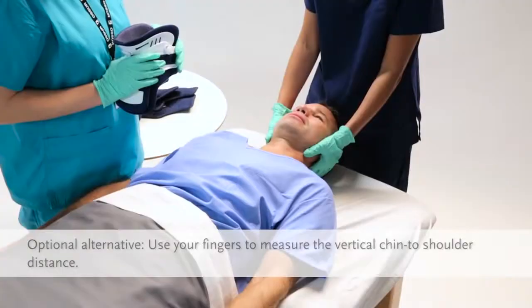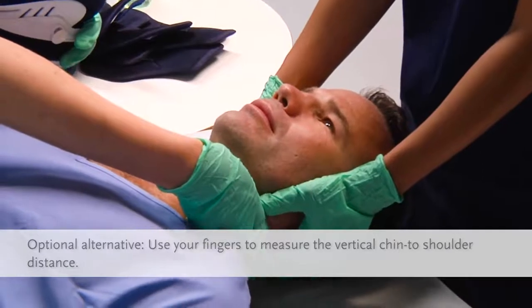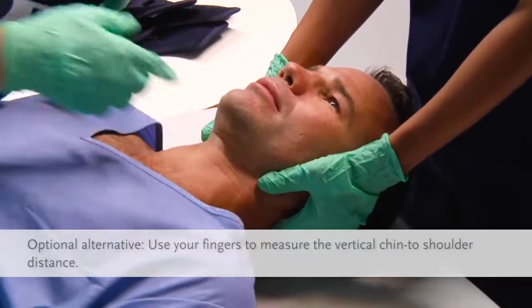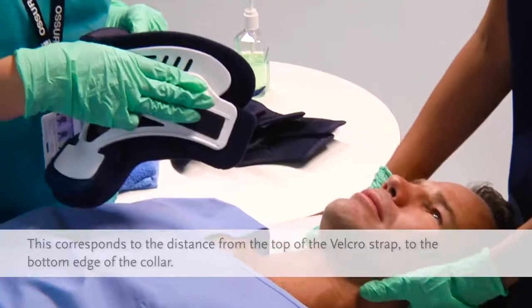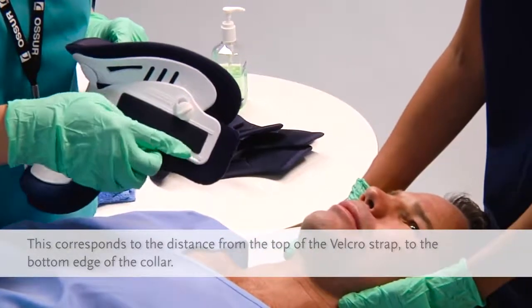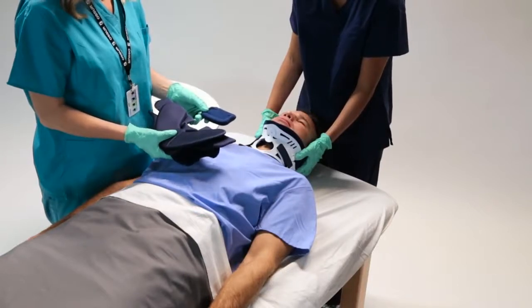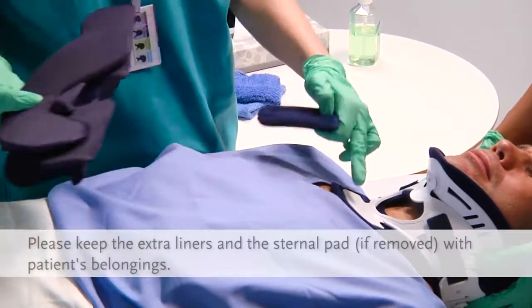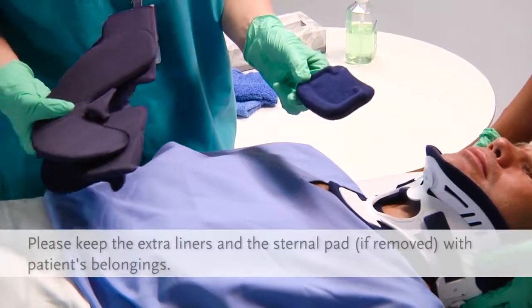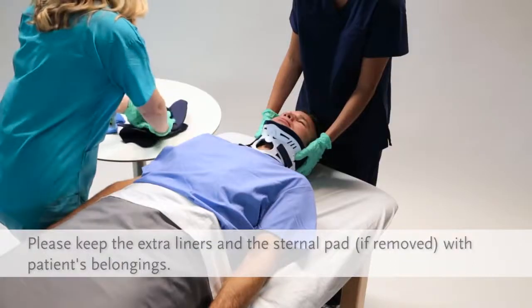A quick collar size check is an optional alternative. Use your fingers to measure the vertical chin-to-shoulder distance. On the collar, this measurement corresponds to the distance from the top of the Velcro strap to the bottom edge of the collar plastic. Many Miami J collars come with an extra set of Sorbitex 2 liners. Please keep the extra liners and the sternal pad with the patient's belongings, in case the collar is prescribed for long-term or at-home use.